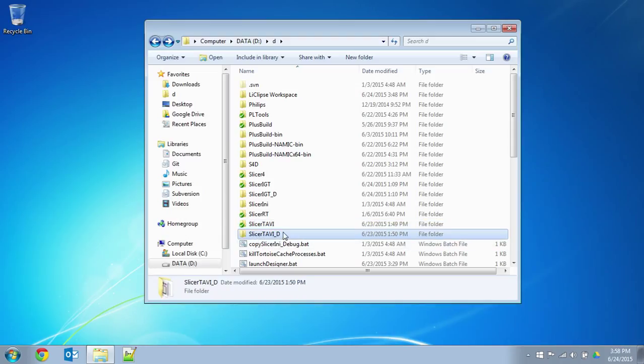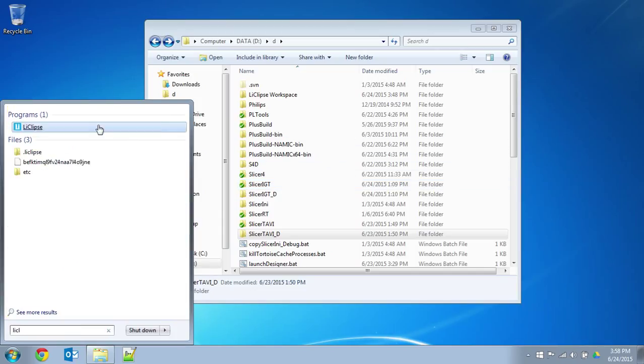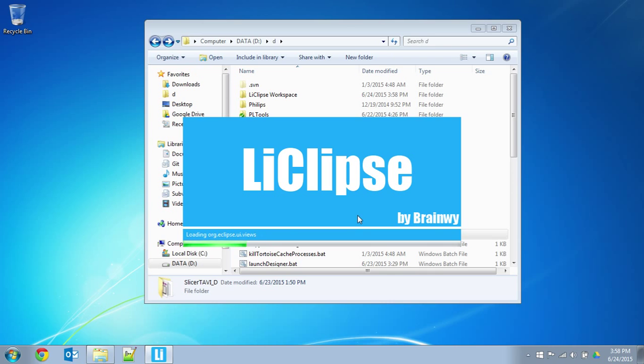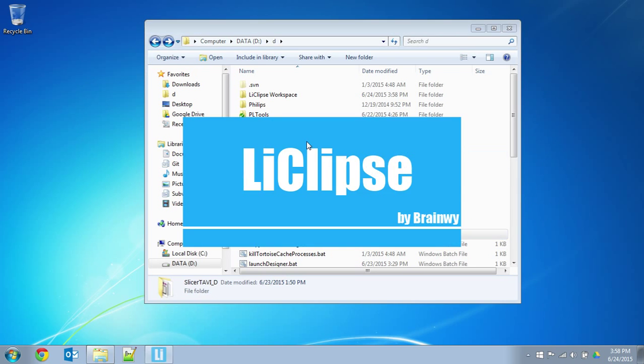So let's get started. First, I'm going to assume you've downloaded and installed LiClipse. I'll add a link in the YouTube description box. But here is mine. And I've deleted my workspace details to have a fresh install. I'm going to choose a light theme because that's what I like. And yes, a restart is required. Why not?